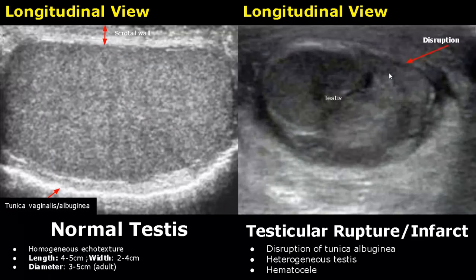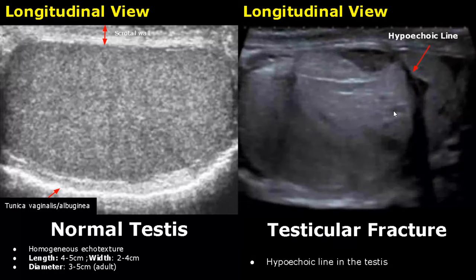In testicular ruptures and infarcts there is disruption of the tunica albuginea. The testis appears heterogeneous and a hematocele can also be seen. Testicular fracture is due to trauma — there will be a hypoechoic line passing through the testis, where a portion of the testis has been separated. This hypoechoic line represents blood.